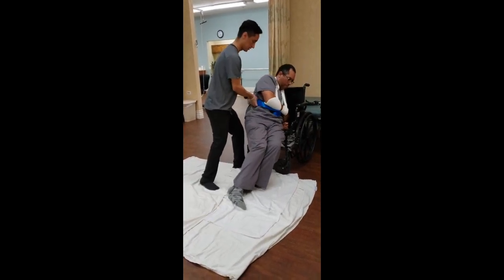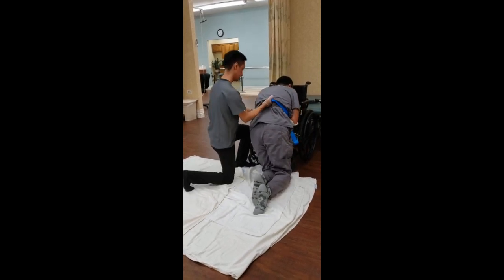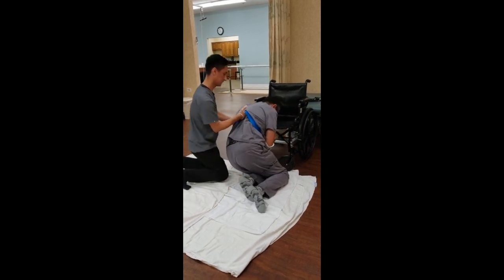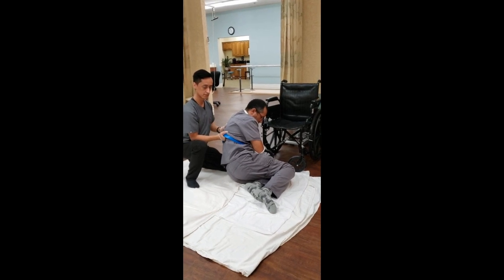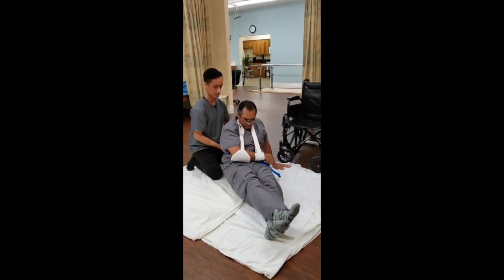You're going to be assisting the patient here. You're rolling. Go down. Good. Now you're going to have the patient bring the hand down. Good. Slowly go down. Make sure that you're keeping a straight spine, using good body mechanics. And then you're going to have the patient kick their leg out.